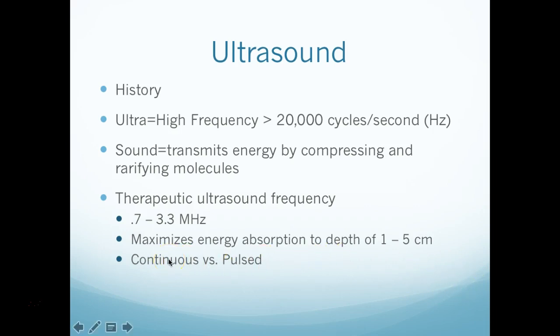Again, like diathermy, you have a continuous mode, which is going to give you that thermal effect. And then you have the pulse mode, which is just going to give you that non-thermal or more mechanical therapeutic effect.